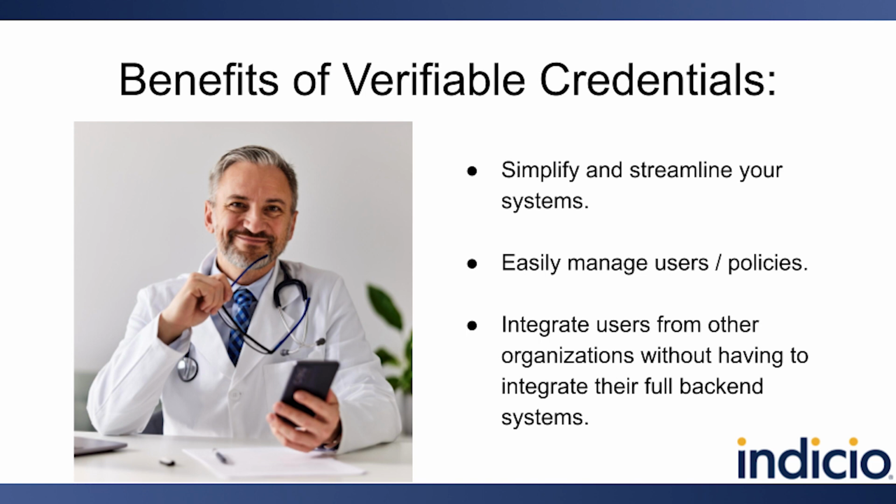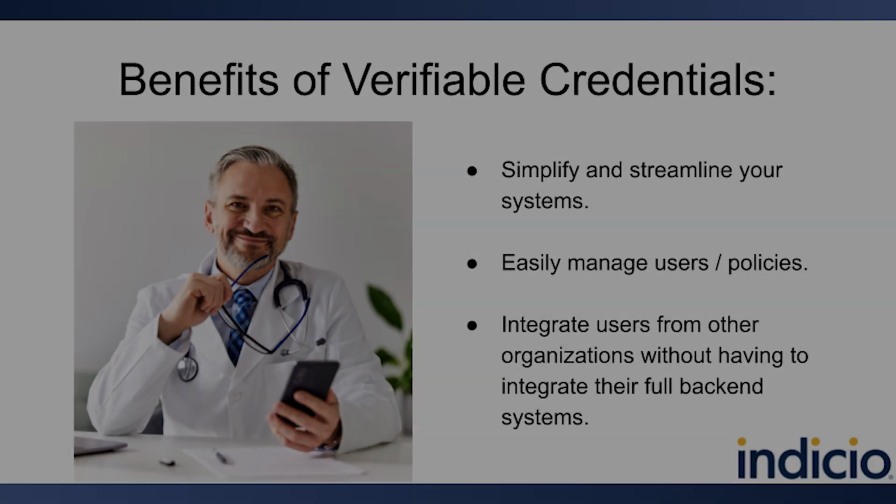And if so, that would allow each hospital to manage their own users and their own policies, and then integrate users from other organizations without having to integrate the full backend systems.